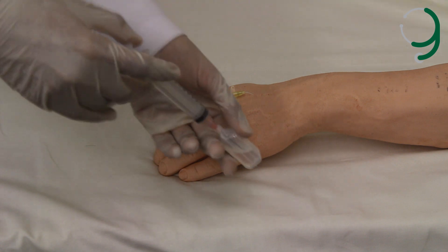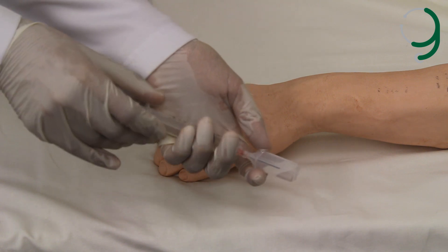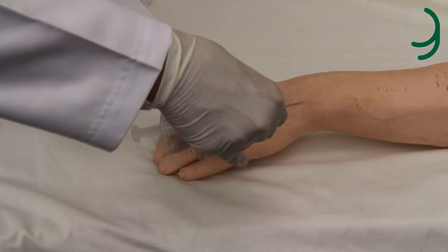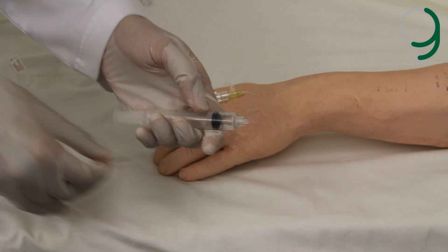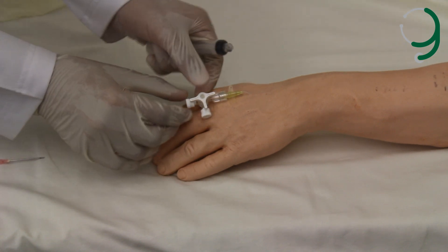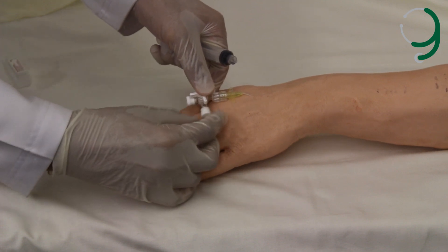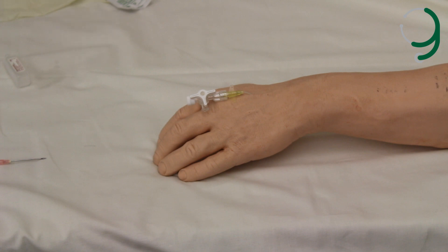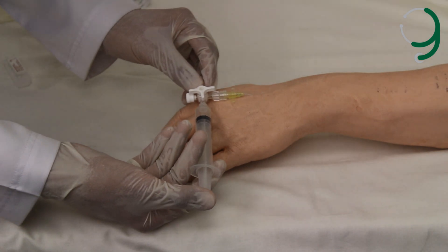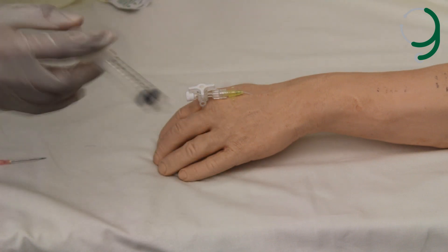Now we draw the drug solution using a needle and a syringe. Once you finish, you dispose the needle. You check that there is no air in the syringe. Now you open the back port of the cannula. Make sure that you swab the cannula with alcohol. Then you inject the drug into the cannula. Once you finish, you dispose the syringe.